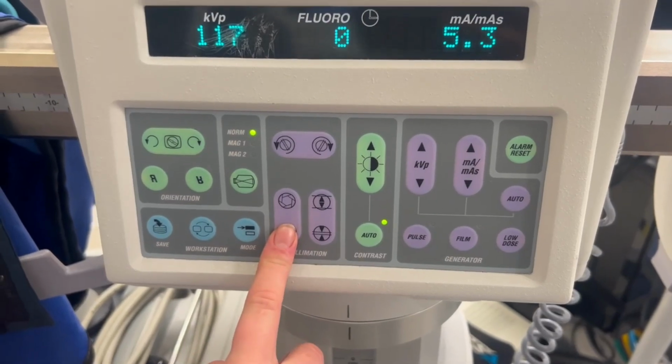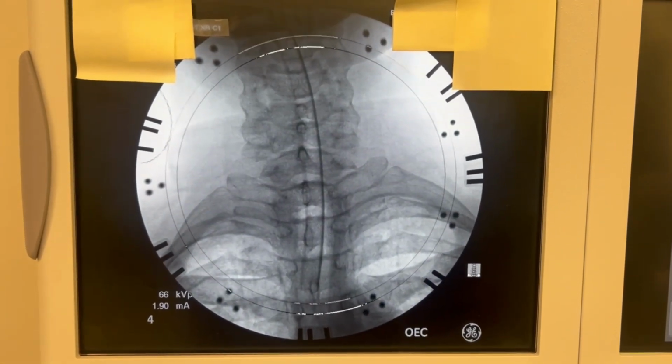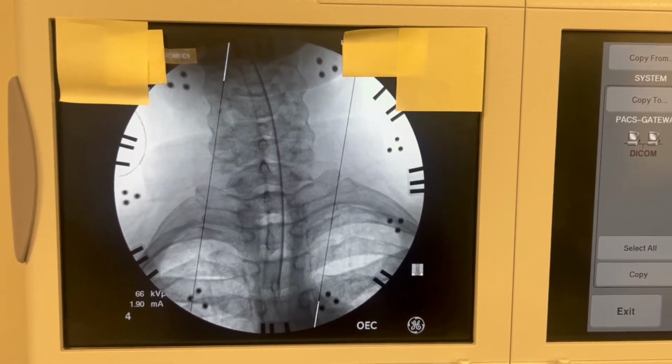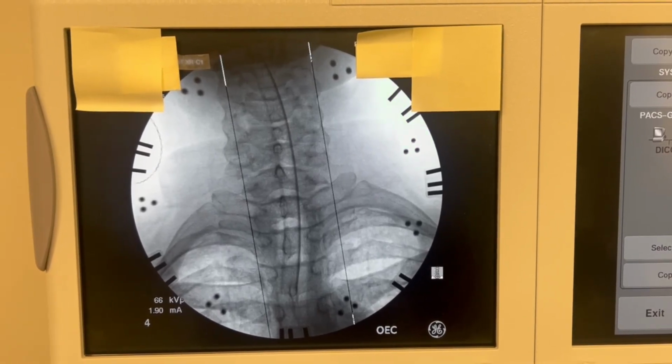The circular collimator is used to open and close like a camera lens. The side-to-side and up-and-down collimator make the image smaller either top to bottom or side to side. Both of these collimator buttons help to reduce scatter radiation and create a much sharper image when reducing the size of the image in either form.